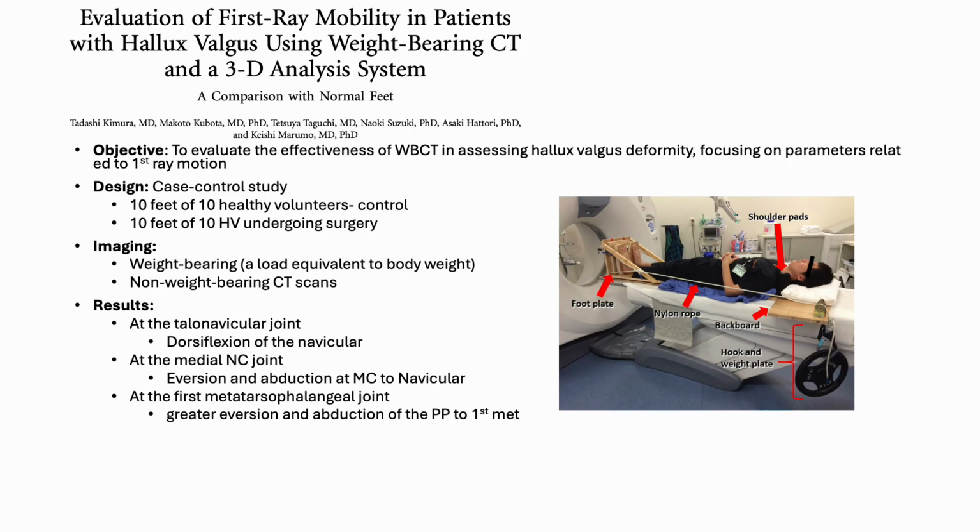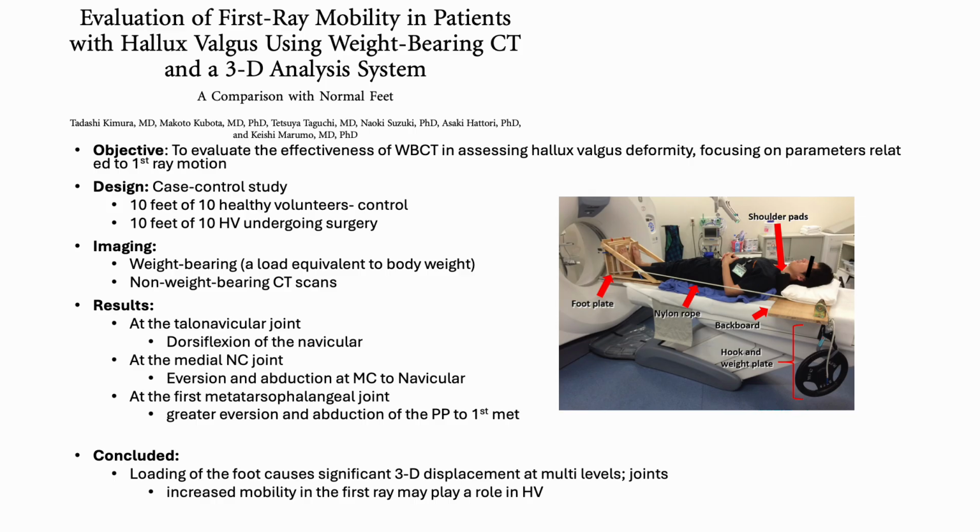And what they found was that when you simulated weight bearing, it changed the foot mechanics. I'm not going to highlight this a ton, but the first ray changed. That's what I want to highlight, that something changed when you load the foot in the first ray, which I think we all just saw in the last flatfoot patient that he gave. You could really see what's going on in that first ray really well. And they concluded that the loading of the foot causes 3D displacement at multiple levels of the joint, and the first ray may play a role in hallux valgus. I think we have all kind of concluded that, but this study really did show that.